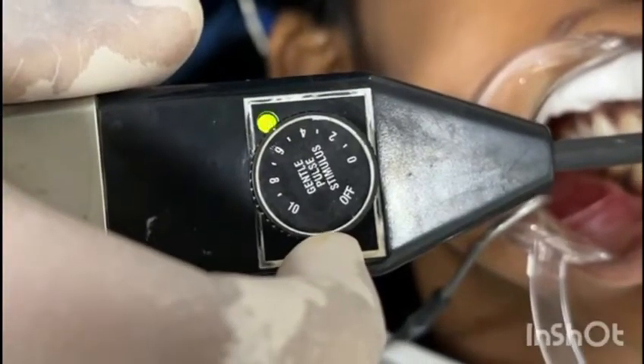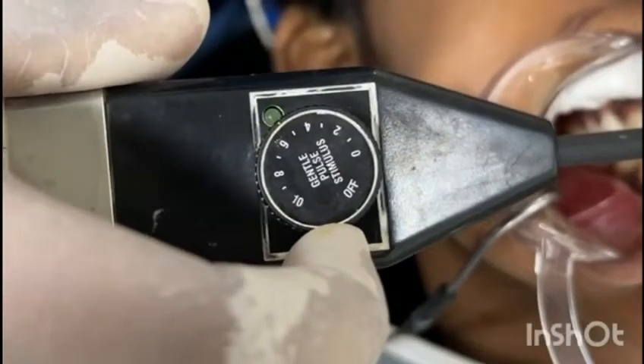The adjacent teeth and opposite teeth should also be tested. No response indicates the tooth is non-vital.